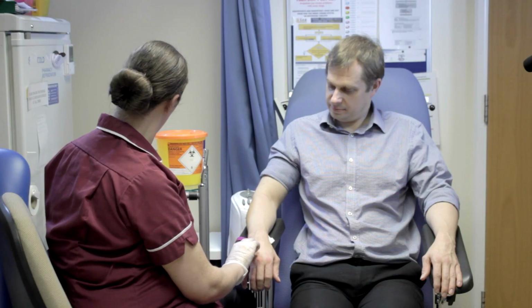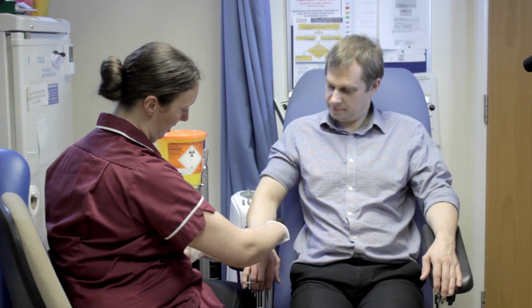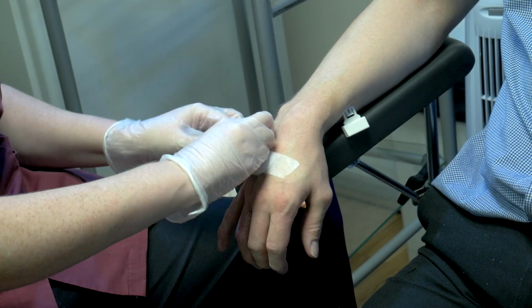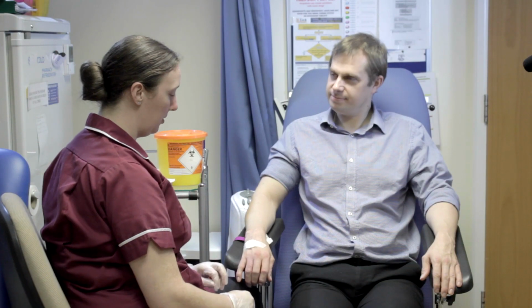So I'm just going to pop that back on and apply a little bit of tape. I prefer tape to plasters because it's not so damaging to the skin. And there we are, we're all done.